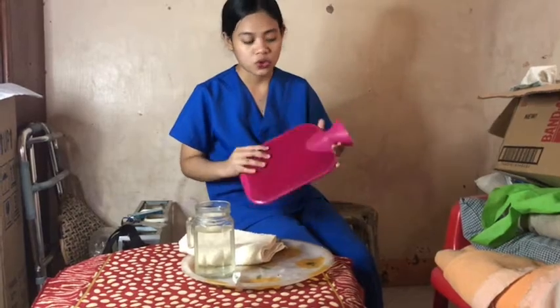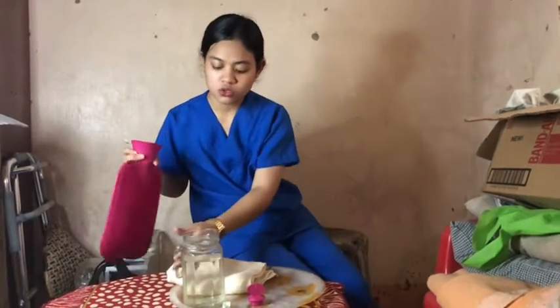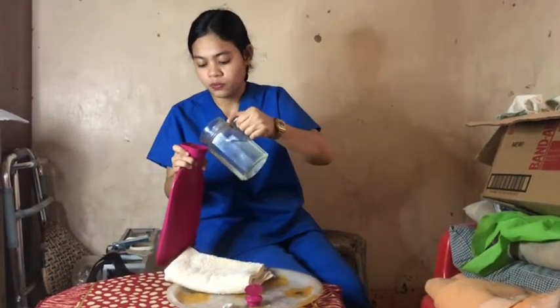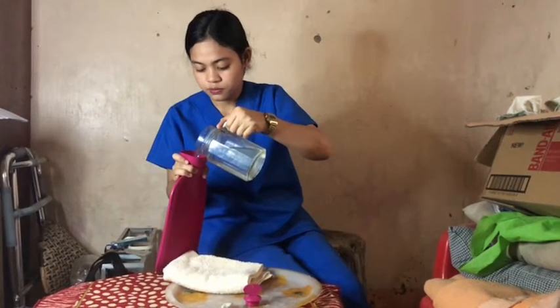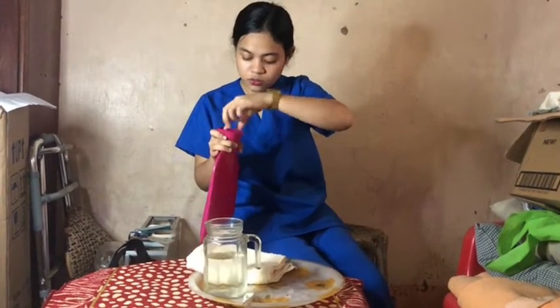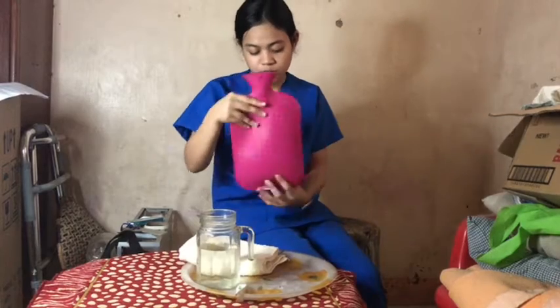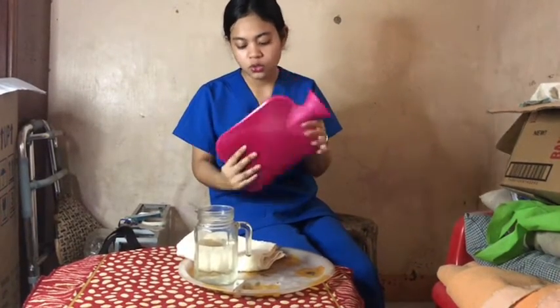Okay, before performing the procedure, we need to determine if there are leaks in our equipment. Since we are going to use a hot water bag, we need to test or check this hot water bag. So I'm going to fill this hot water bag with water. Let's just assume that I am filling this water from the sink of the nursing station. Okay, then close the hot water bag. Then I'm going to turn this upside down. Okay, there is no leakage.